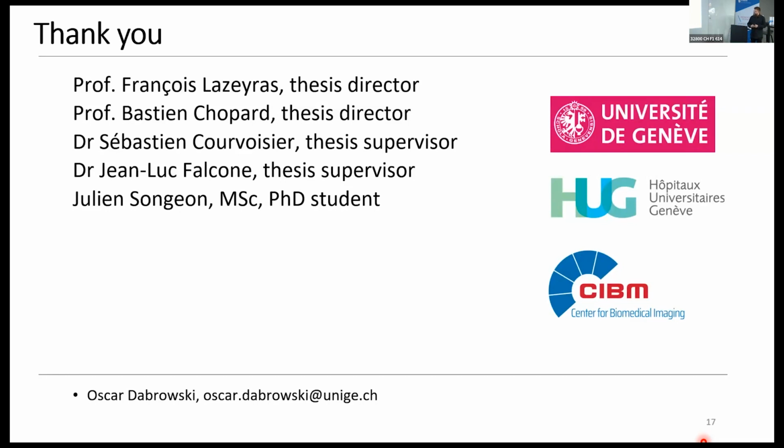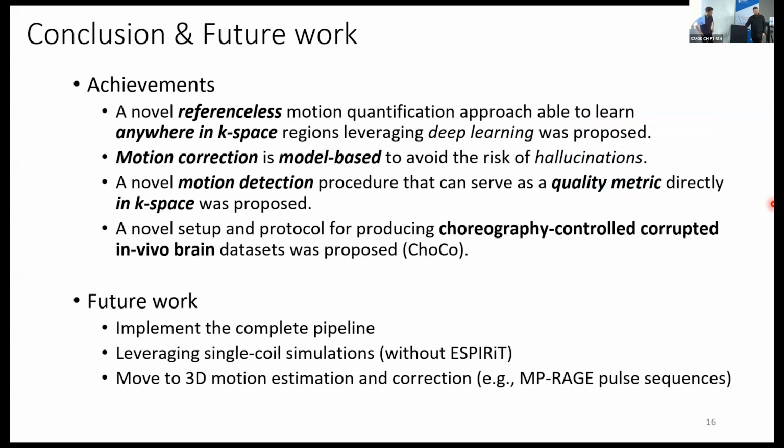Yeah, thanks for the very nice presentation. I was wondering, based on the last point that you raised, how long does it take now? So once you've trained your algorithm, essentially applying it takes very short time. Yes. So is it something that could be implemented at the console, for example, so that this image could be corrected and the MR tech could decide, okay, we still have to redo the scan, or it's good enough now with the motion correction? Yes, absolutely.